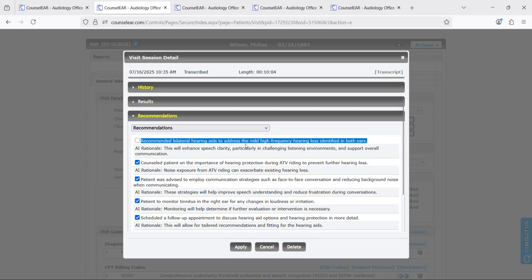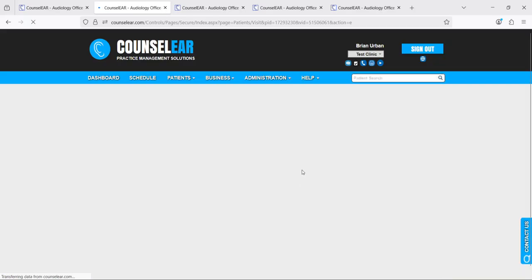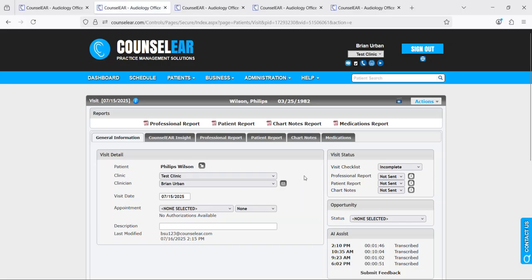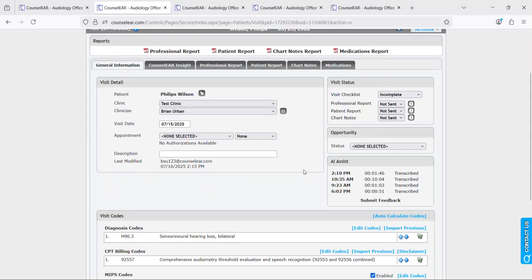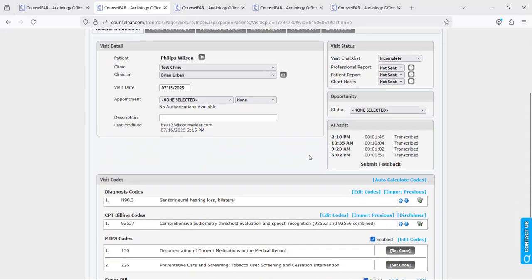So in the recommendation section here you'll see a little bit under the bottom that says AI rationale. So this is the recommendation, this tells you why the system thought that it applied. So if you said, ah you know I don't really like one of these, great go ahead and remove it. That's entirely up to you. So you have full control at that point as to what happens in the visit itself.